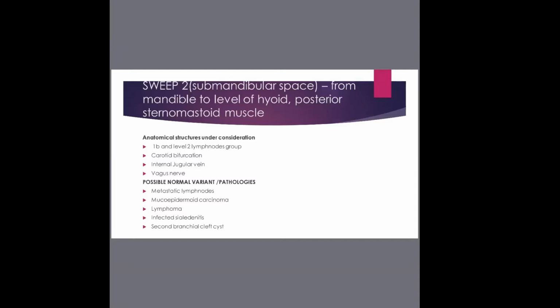In the sweeps, you're looking for lymph nodes. You have to look for those lymph nodes. Make sure that the echo texture is firm, that they've got a fatty hilum. If you see a lymph node that is hypoechoic without the fatty hilum, and the shape is rounded, such a lymph node may not be cancer, but I wouldn't let it go.